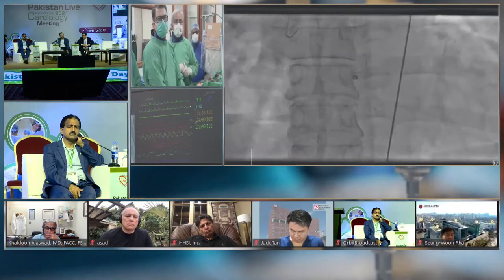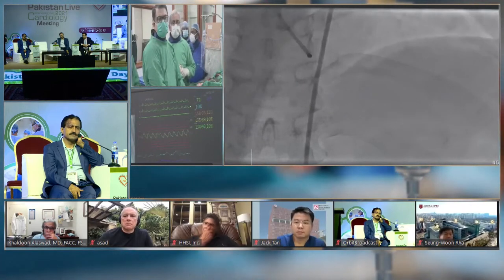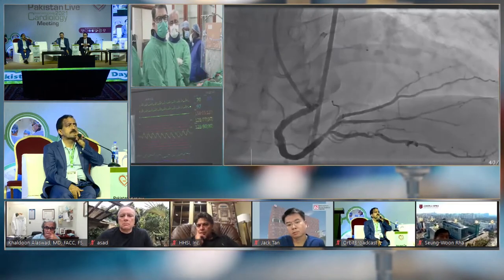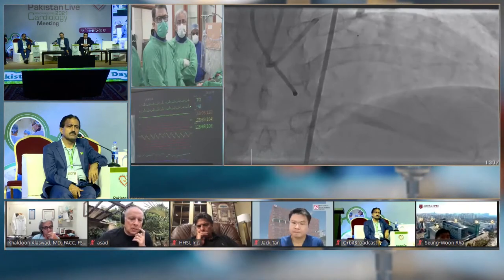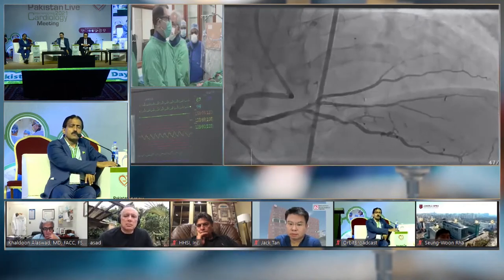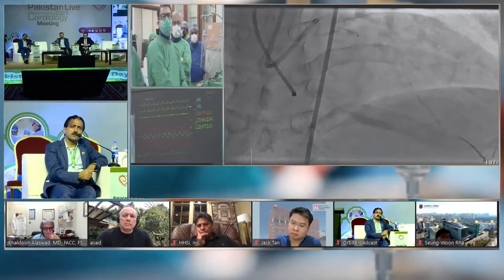So once you got the equipment in there, we took another picture. Next please. So now what we did was we have a micro catheter sitting right at the ostium of that tapered stump. Which microcatheter? This is the Fine Cross, and that seems a very wonderful catheter.